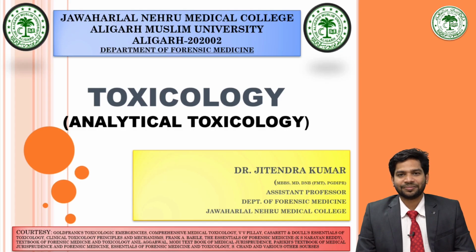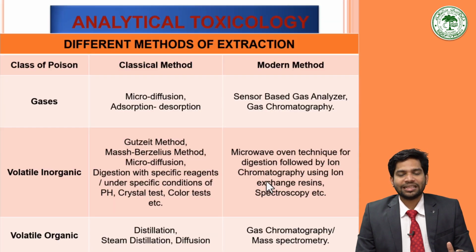Greetings, dear learners. We were learning analytical toxicology. Up till now, we have finished different extraction techniques before the final detection of drugs and poisons, that is, pre-treatment of the biological matrices, before the final analysis of the analyte. So, in the last class, we learned the classical and modern methods of the extraction.